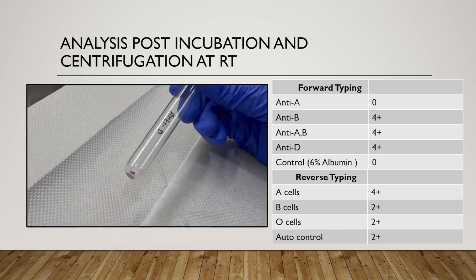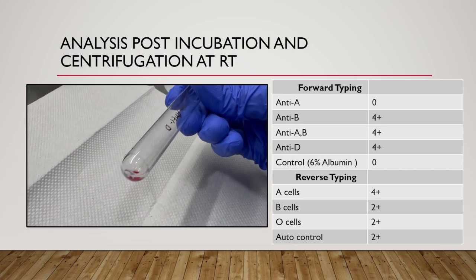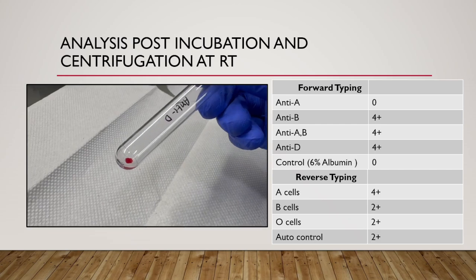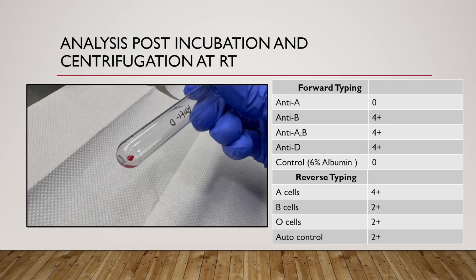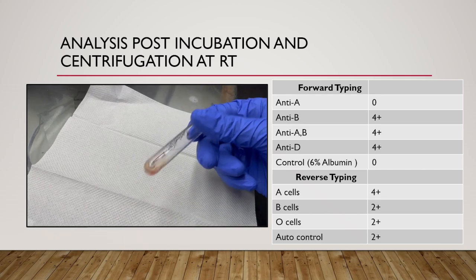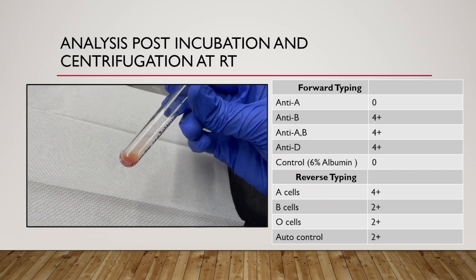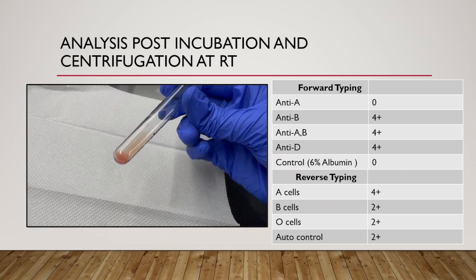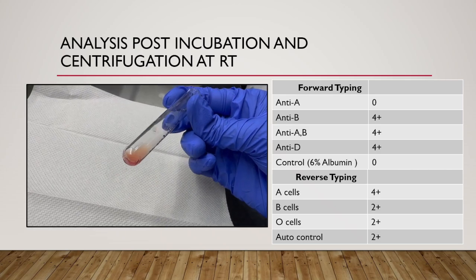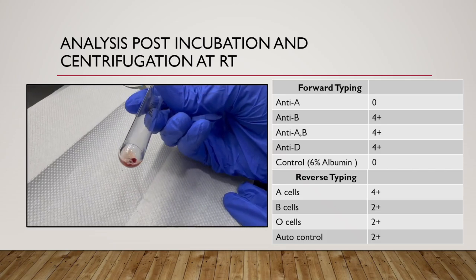And next, coming to the tube of anti-D, here also we can see a 4 plus agglutination reaction. And the control tube of 6% albumin, there is no agglutination reaction. From the forward grouping, we can assume that the blood group of the patient should be B positive.